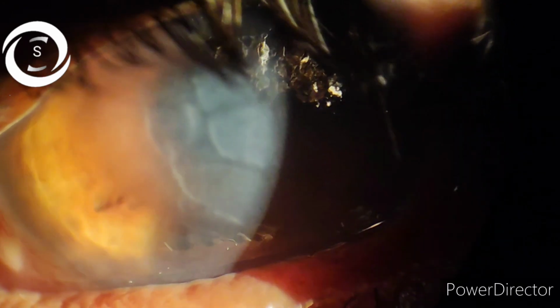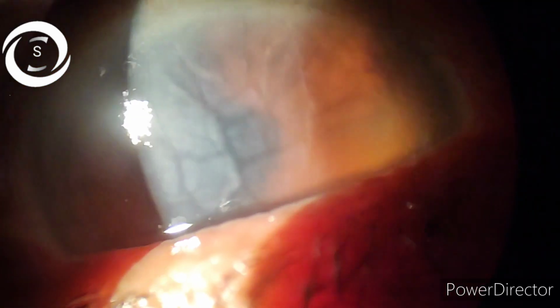I encounter small detachments in routine that occur at the phaco main incision port. The stripped Descemet's membrane is typically seen near the incisions like a flap, loosely adherent, floating in the anterior chamber with rolled up edges, and it moves vigorously while irrigating the anterior chamber. On slit lamp examination, Descemet's detachment is diagnosed as a clear optical space between stroma and Descemet's membrane. As it is a transparent membrane, it is first treated by injecting a blue dye, trypan blue, into the anterior chamber to stain it so it becomes visible.